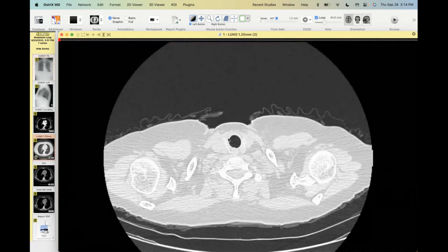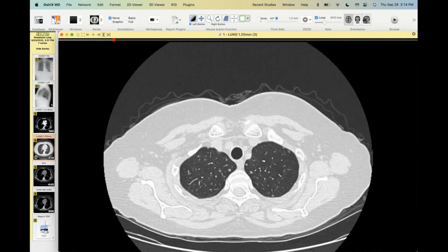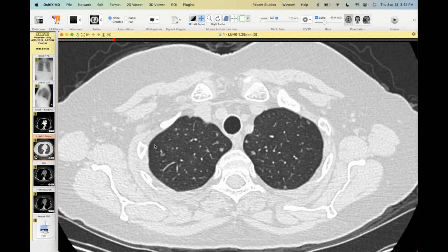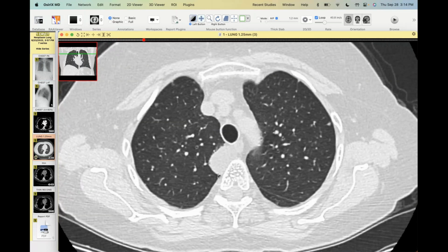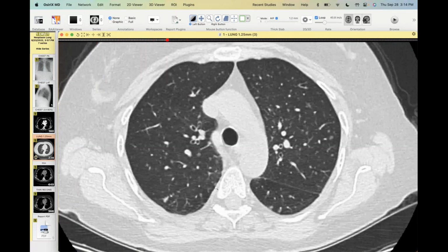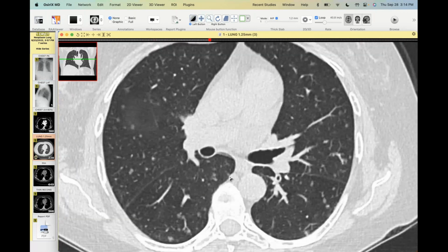She ended up having a neck CT for some reason that showed this. A lady in her 60s undergoes a series, as you can see, of 4 chest CTs, eventually ends up in a surgical lung biopsy because nobody knows what this is. These are all done outside, obviously, because they didn't send them to us. I think this looks like some sort of little duplication cyst. That's fluid, but these things, we rarely get path on these because I think at least when we show them on here, we know what they are.